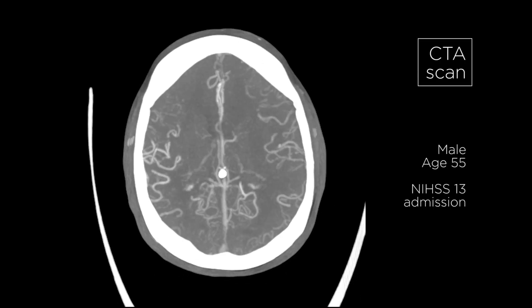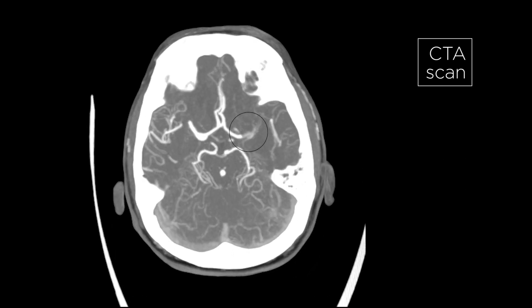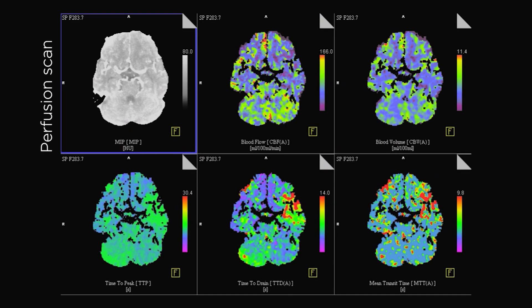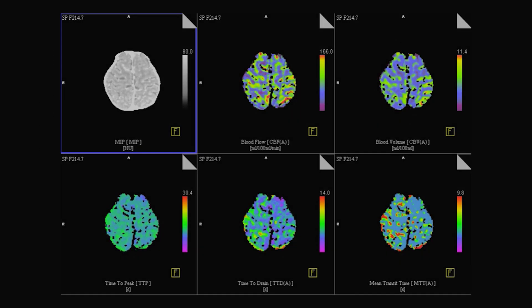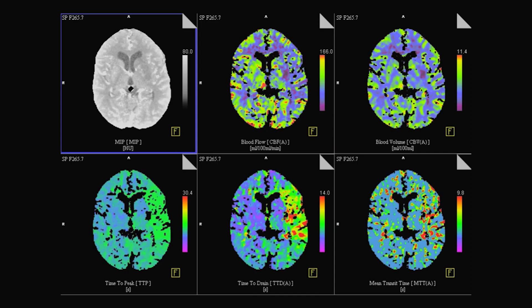In this case we have a patient with a carotid T occlusion on the left side — a relatively young patient. On CT perfusion there is a big mismatch on the left side because of this occlusion, but on CT angiography we have a good collateral status over the ACOM.